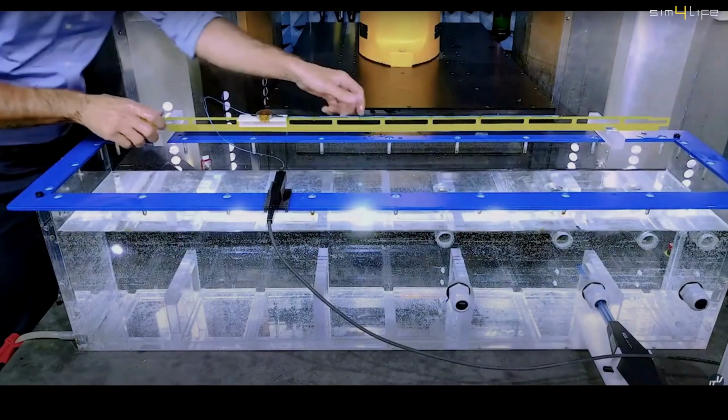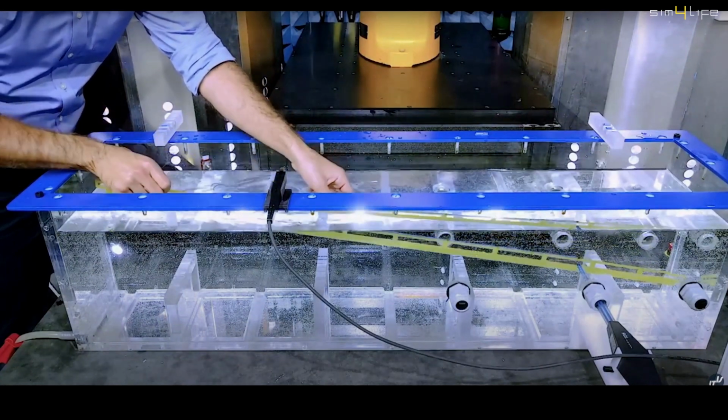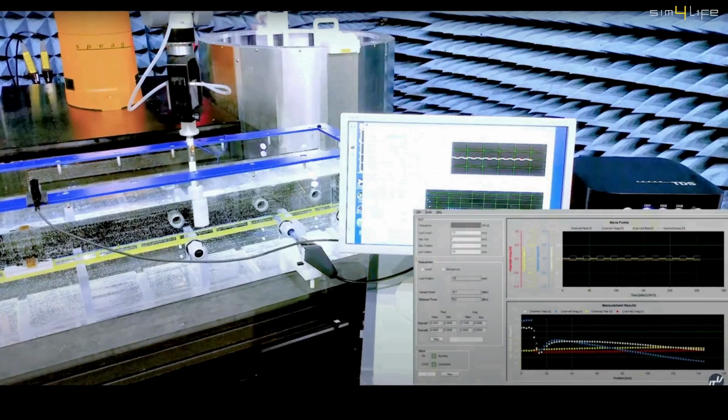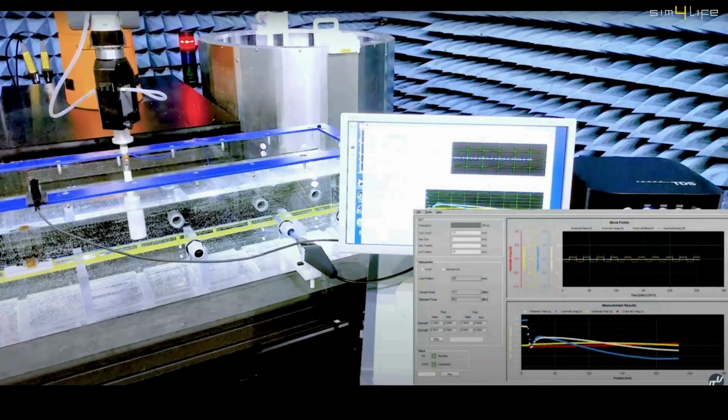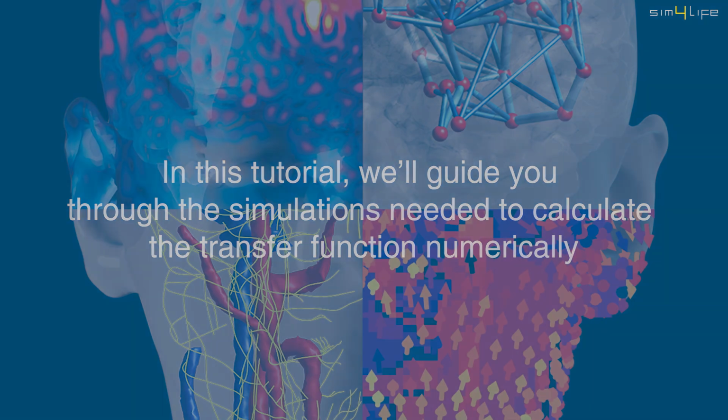One common approach to derive the transfer function involves applying piecewise excitation along the length of the implant, using a moving source, and measuring the response of the electric field near the implant tip. In this tutorial, we'll guide you through the simulations needed to calculate the transfer function numerically. Let's get started.